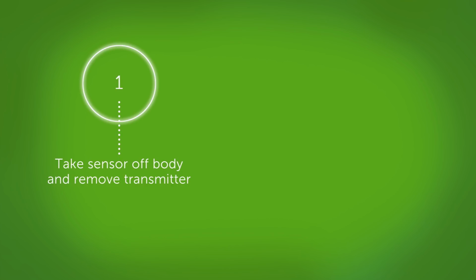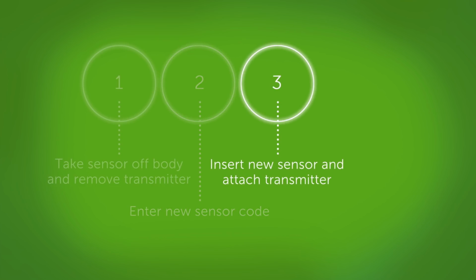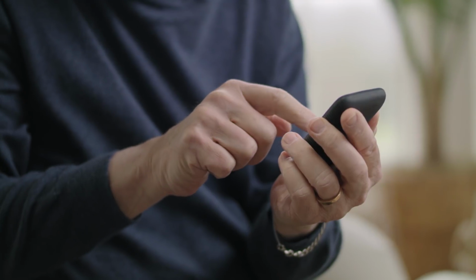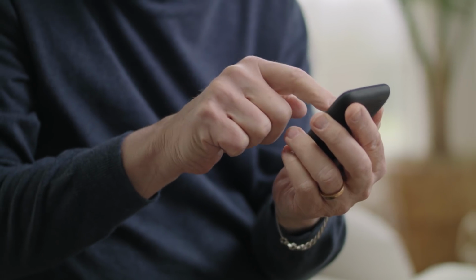To replace your Dexcom G6 sensor, follow these steps. First, take the sensor off your body, then remove the transmitter from the holder. Second, enter a new sensor code. Third, insert a new sensor and attach your transmitter. Fourth, start your new sensor. The system will guide you through these steps. Let's watch Bruce replace his sensor.